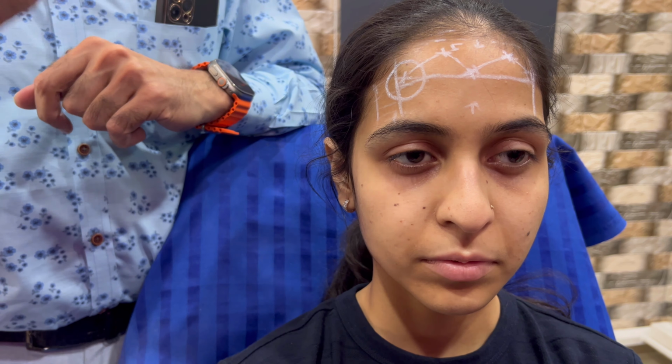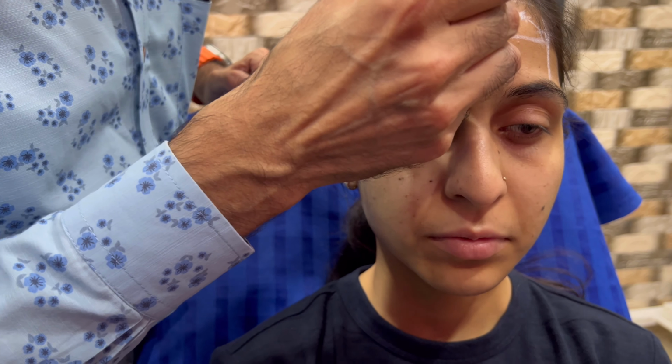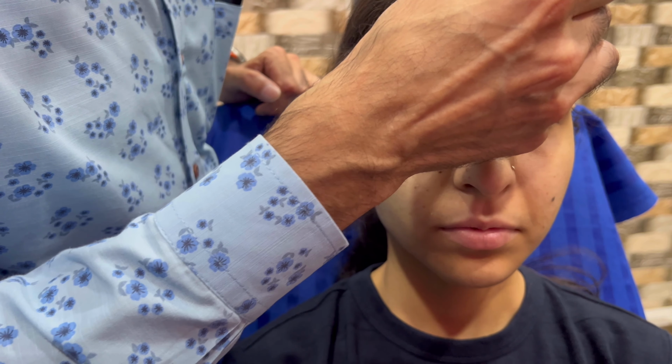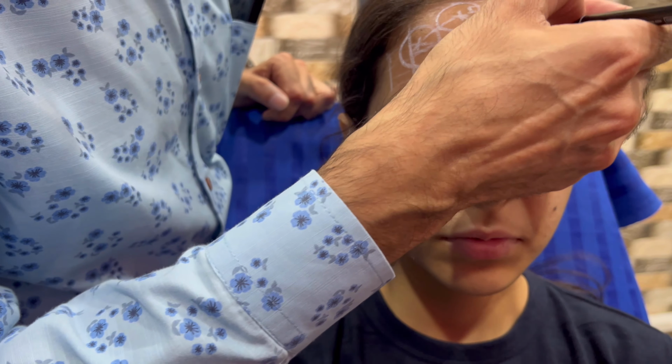So you're trying to create Olympic rings like this, so that the rings can coalesce with each other and give you a desired result.